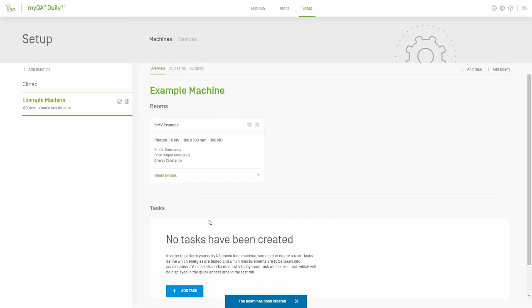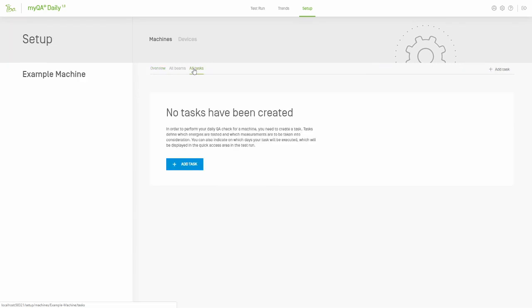With a machine and a beam defined, you can now create a task to measure that beam. Just as before, you go to the Setup and select your new machine. Then click on All Tasks. From there, you can either click on Add Task in the top right, or the blue Add Task button if you have no tasks defined.